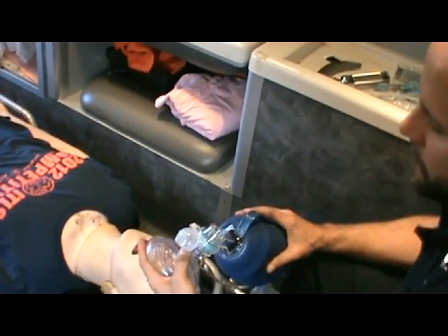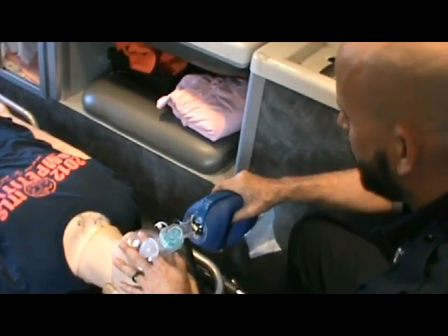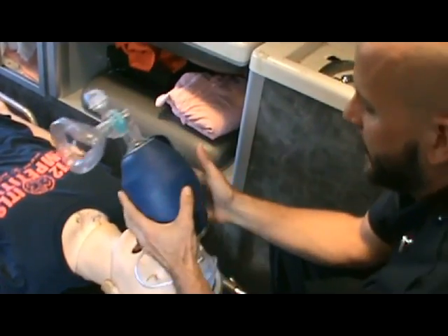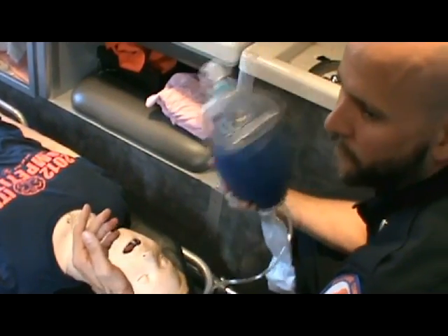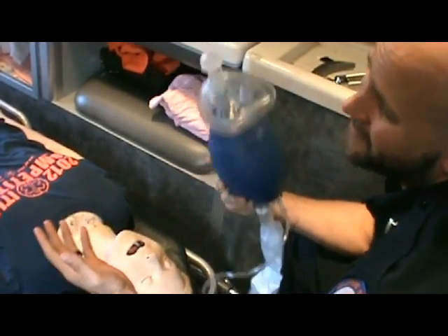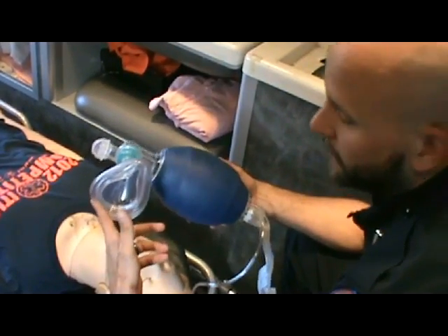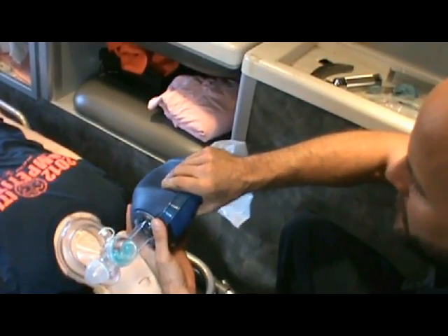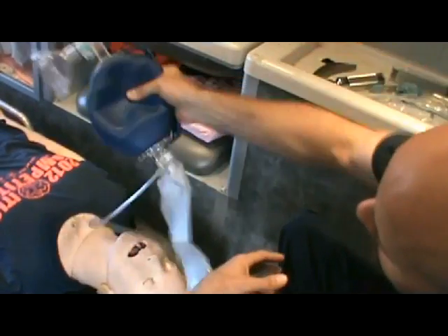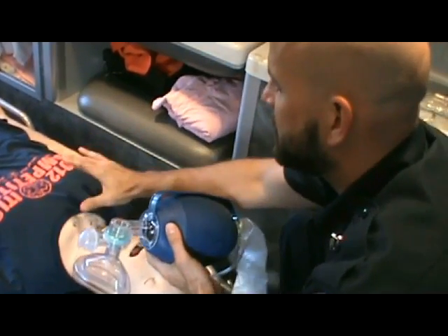Regarding too much volume — this is a one-liter bag, but filling an average adult's chest only takes about 400 to 600 mL. Six hundred is pushing it for a really big person, because we're talking 5 to 7 mL per kilogram. All I need to do is give about a half squeeze — not a full squeeze, I don't want to feel my fingers on either side of the bag. I just need to see chest rise.